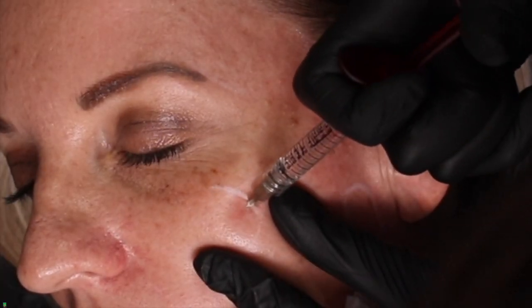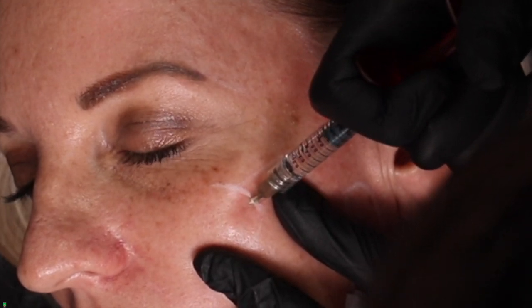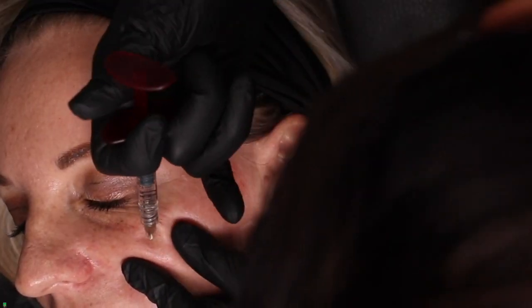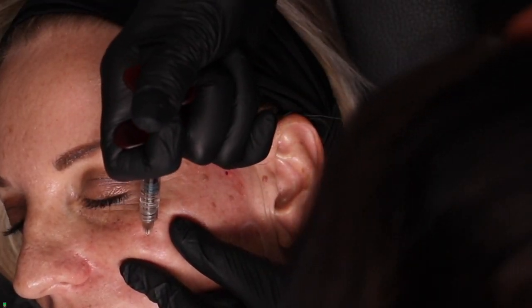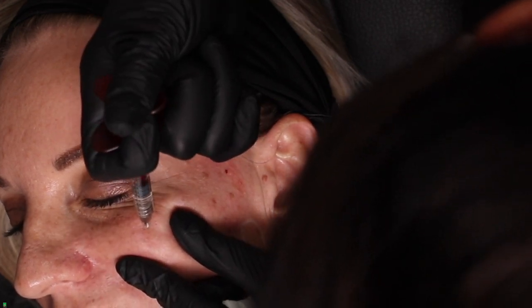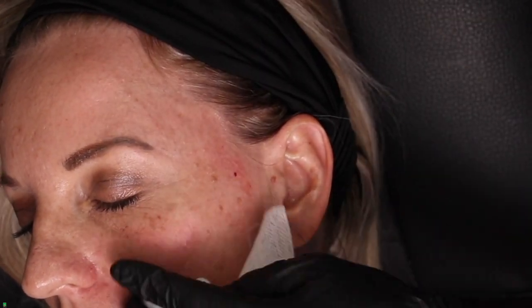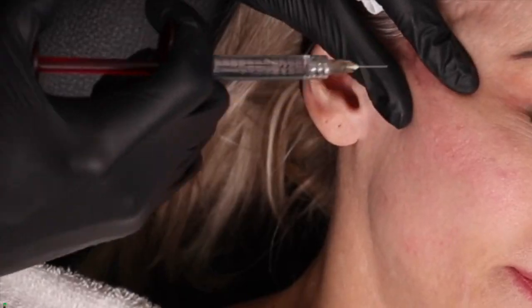Now we're moving over to the malar eminence area. Again, first aspiration and then only start injecting in a bolus technique, checking the skin all the time. You can obviously move to other areas to retouch, especially at the end after checking symmetry. But again, as soon as you move your needle, aspirate before you inject. So this is the medial and then the malar eminence.